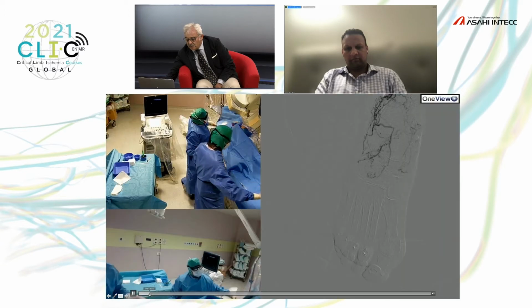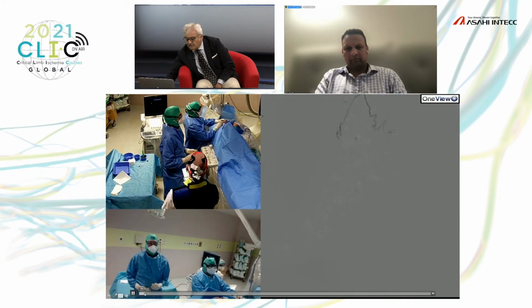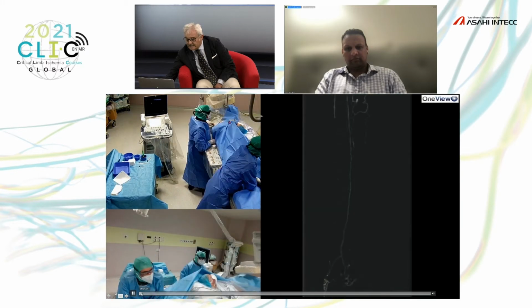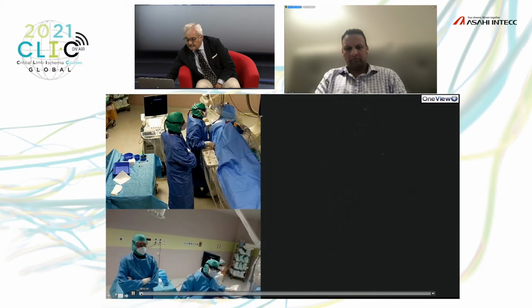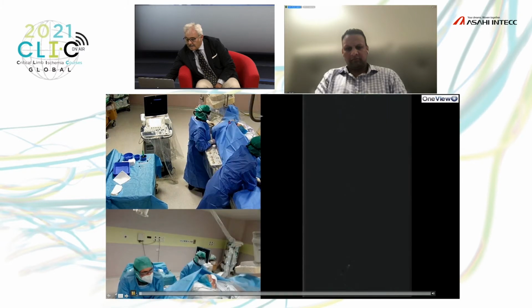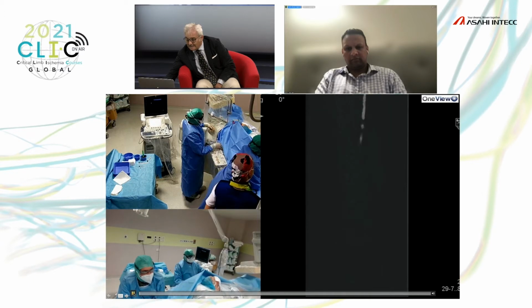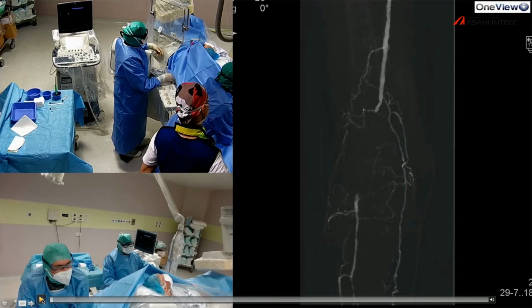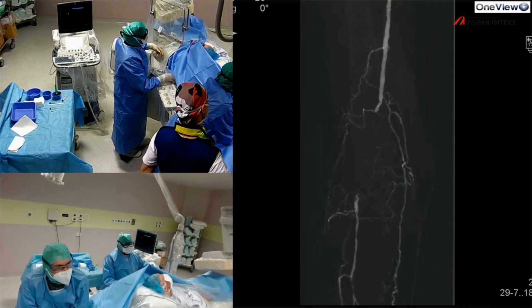I would like to stop the movie a little bit in this area. Okay. So there is a lesion in a particular area.